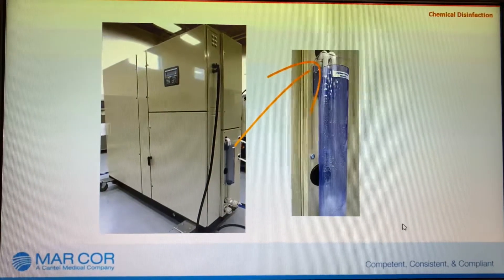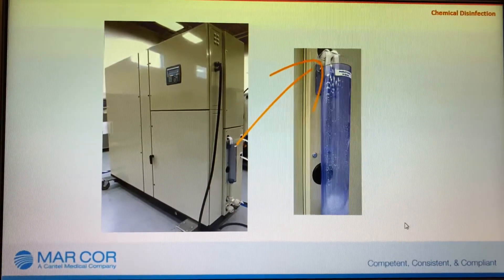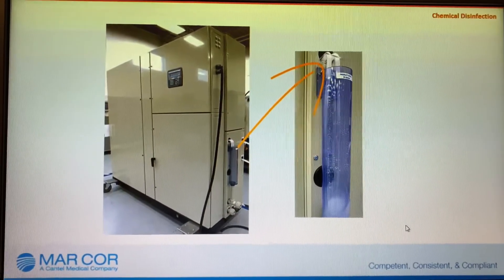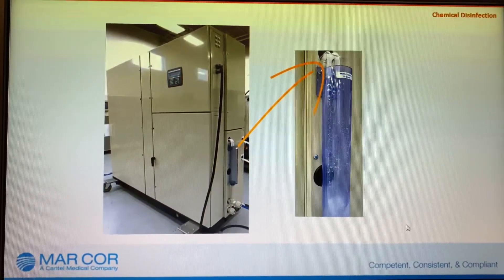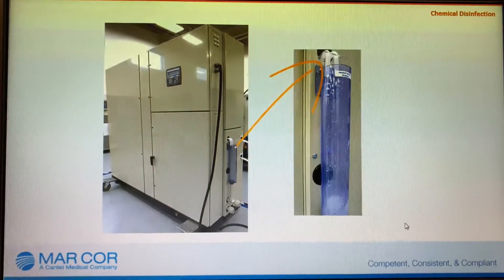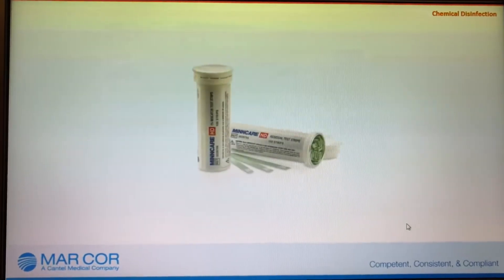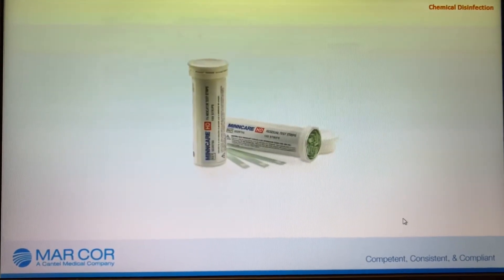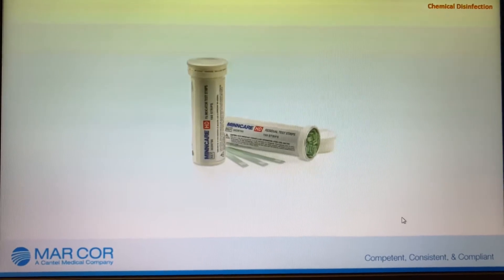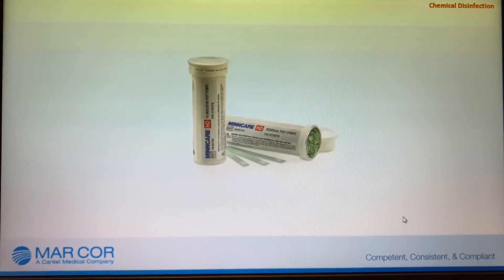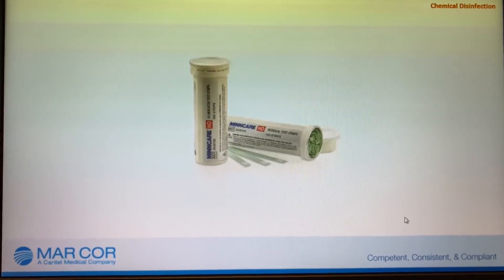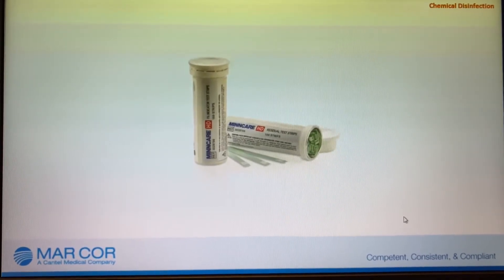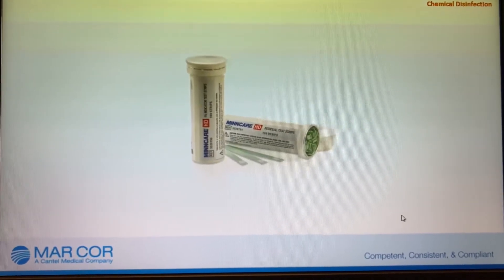If needed, continue flush to drain and repeat water sampling until there is no reaction from the test strip. A test for residual MinCare HD disinfectant after rinse must be performed before the initiation of the next dialysis session.